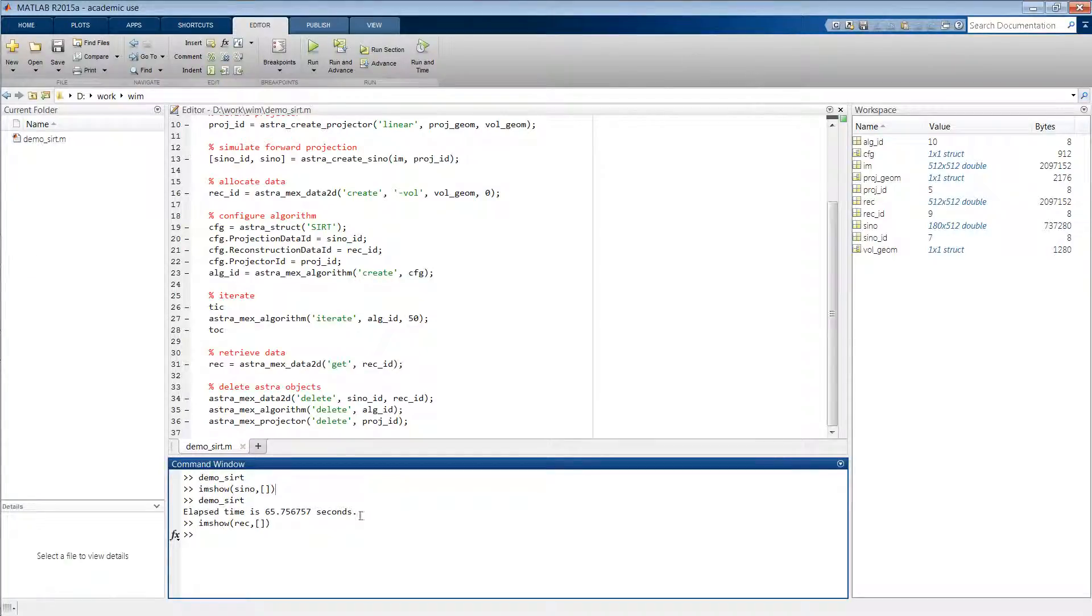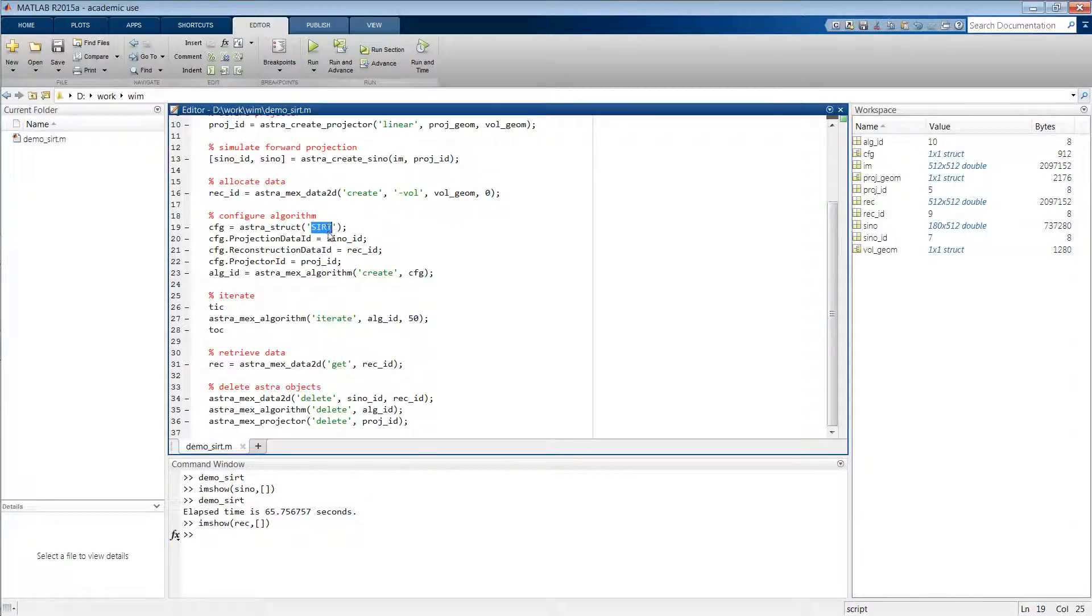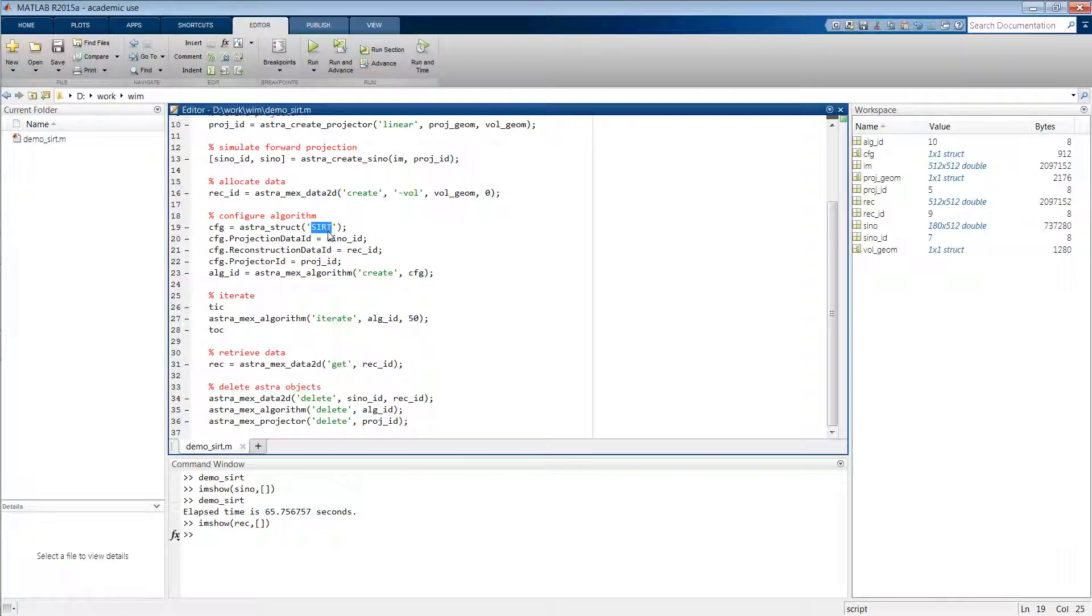So this fairly simple reconstruction took us slightly over one minute, which is of course very slow. And the reason for this is that we are here using a SIRT implementation that is built on the CPU. Now the ASTRA toolbox also provides a hardware accelerated SIRT implementation using the NVIDIA CUDA language.